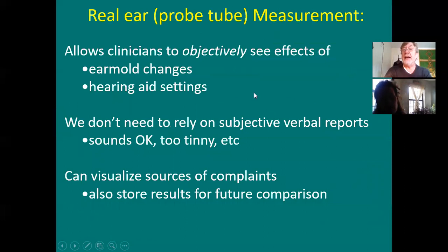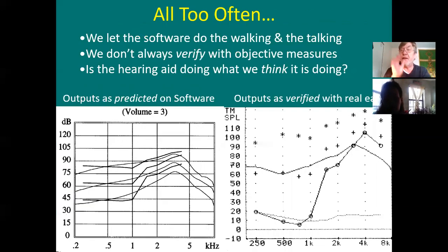Real Ear measurement, yeah. When you're doing the Real Ear measurements, are you able to put into the system if you're using the NAL-2 or the DSL5? Does it automatically? Nope, you choose. Thank you for asking, because when you take the audiogram from NOAH, you put it into the Real Ear system, and then you choose what's your fitting method. DSL5, NAL 2, NAL 1, take your pick. And once you picked your fitting method, then you hit enter, and there come your targets.